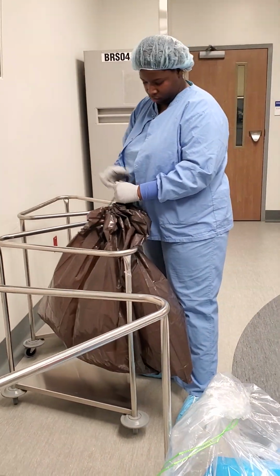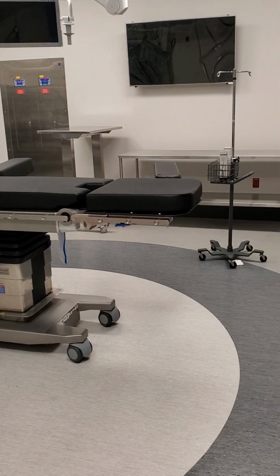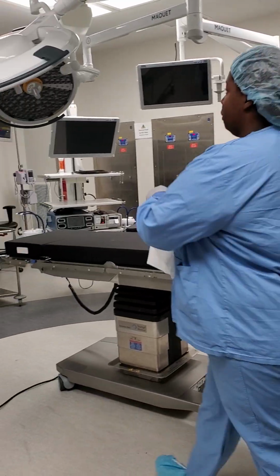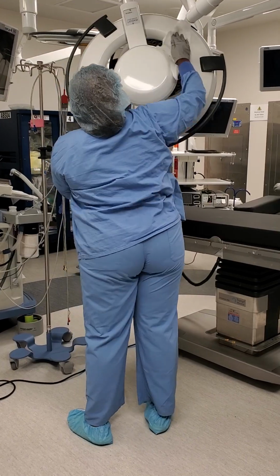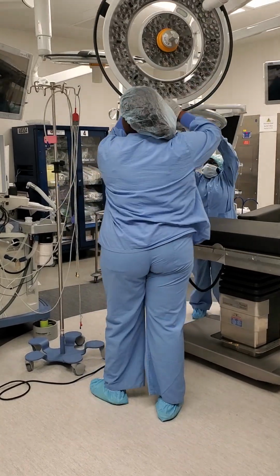Now that all dirty items have been removed from the room, we can start cleaning the room. You want to get your cleaning towels. They need to be moist but not soppy wet. And we always want to start at the top of the room with the lights, cleaning both the back side and the front. Then we would move on to the TV monitors.